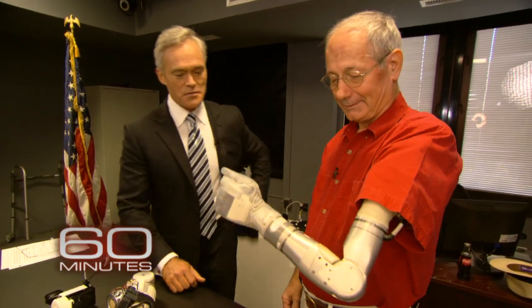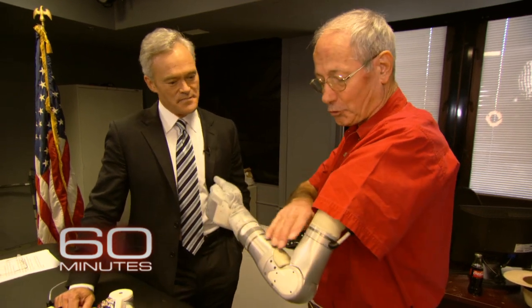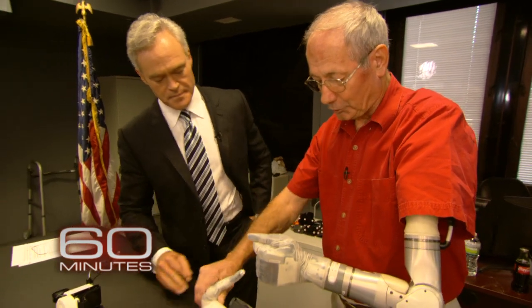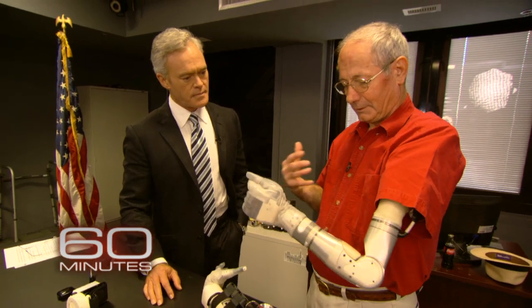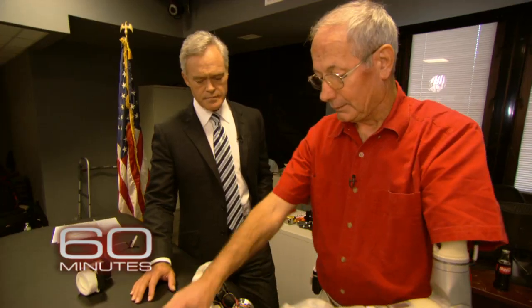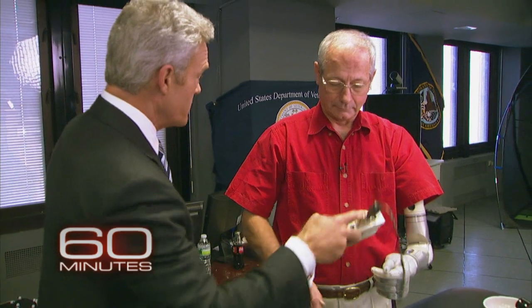But now look at this. This is called the Generation 3, the Gen 3 arm. How is it different? Well, as you can see, it's much more streamlined — if you compare the two of them, it's obvious how much more streamlined it is. The wires are now internal. This big old box here, this computer, is now internal. This you used to wear on your belt — this was the computer that drove the thing. Now all of this is inside the arm itself.